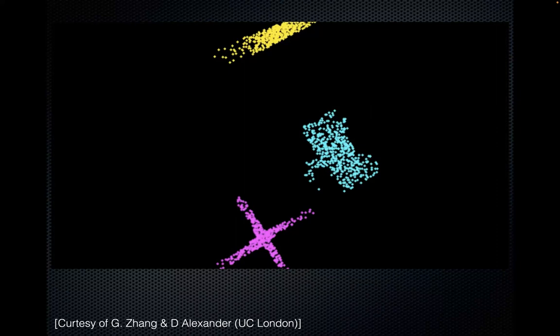This is diffusion MRI. This is what we're going to measure with your water molecule. It's just that suddenly your water molecules are in your brain, they're trapped in your tissues, or they're free in CSF or blood. And that's going to allow us to make measurements, to make images, because the deviation from free will create a contrast.